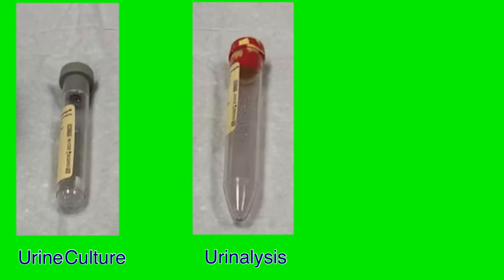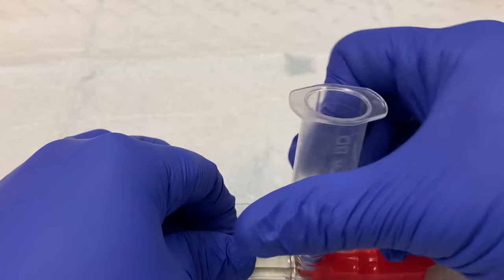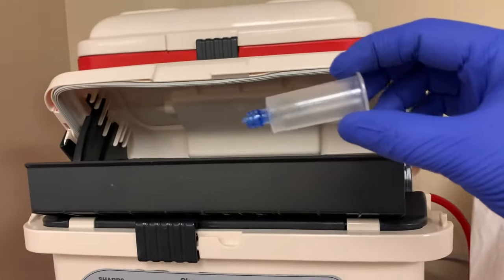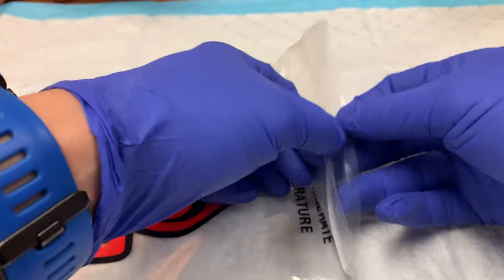Always insert the tubes in the same specific order: gray top for the culture, then marble for the urinalysis, then white for the extra urine. There are preservatives in the gray and marble top tubes, and if they are transferred out of order it can contaminate the sample and ruin it. So always collect them in the same order — gray, marble, white. With the samples collected, detach the adapter from the catheter and dispose of it in the sharps container, because there is a needle in it. Label your tubes appropriately, task it off in EPIC, and send the tubes down to lab in a biohazard Ziploc bag.